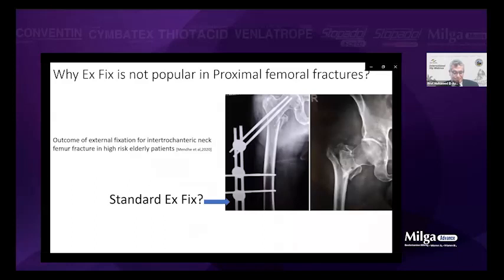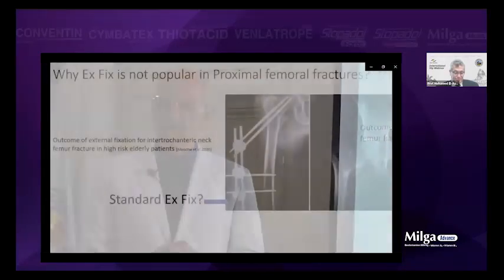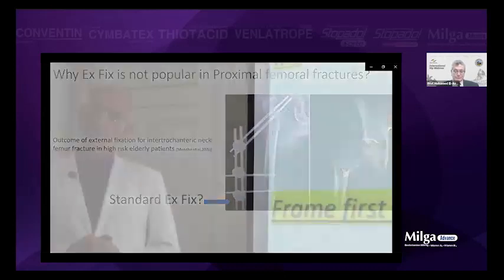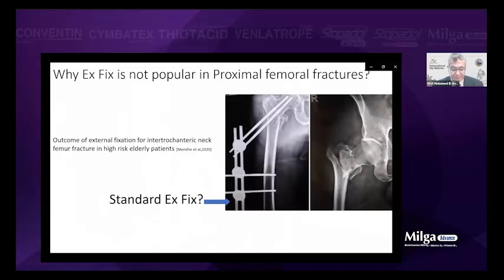So I think the companies and some people, they design a frame and they want to fix all the fractures with this frame. And this is not applicable. I will show you how to fix the proximal fractures. And we put the frame last, not first. So our technique is not a frame-first technique, because the problem comes if you apply the frame first.